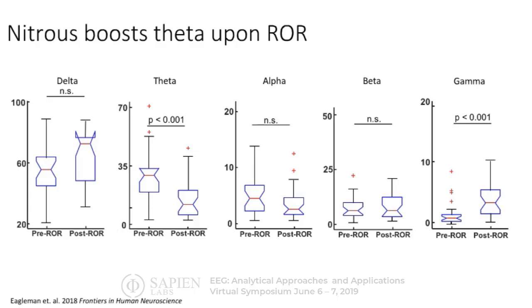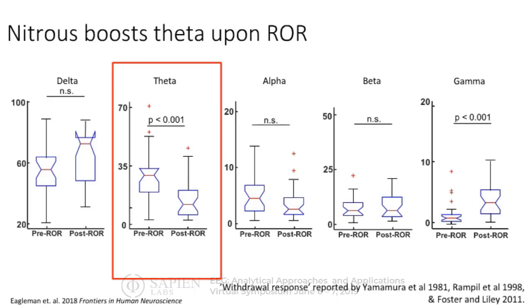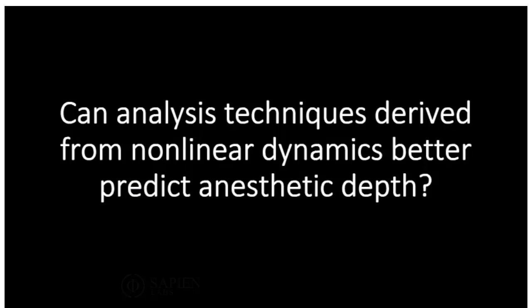The most interesting thing that I found is a significant increase in theta activity. And I was quite surprised by this. When I noticed this, I turned to the literature, and it turns out several other labs have reported this occurring when they turned off exposure to nitrous oxide. I didn't find anything about this with respect to remifentanil. But nobody really said why this occurs, and I'd be happy to speculate on this later, but my pet hypothesis is that it might be due to the role of nitrous oxide as an NMDA antagonist. So maybe this is coming from the hippocampus being suppressed for a prolonged period of time, and so you get this big burst of theta after you stop inhibiting it with nitrous oxide. But again, happy to speculate on that later.